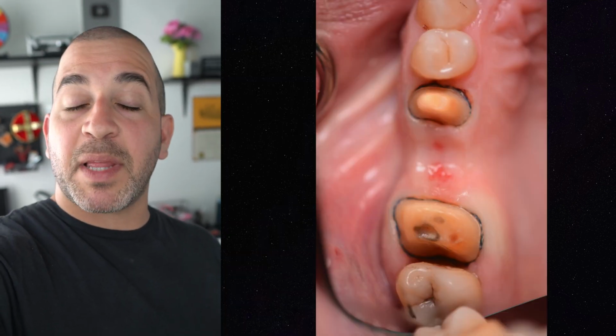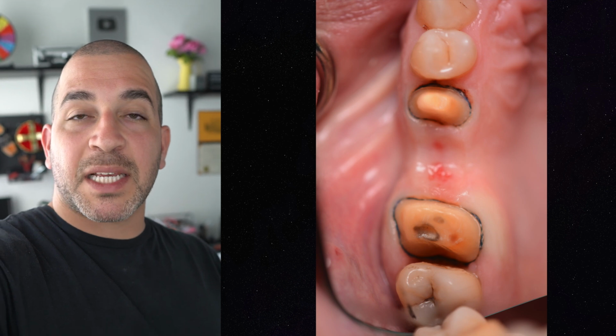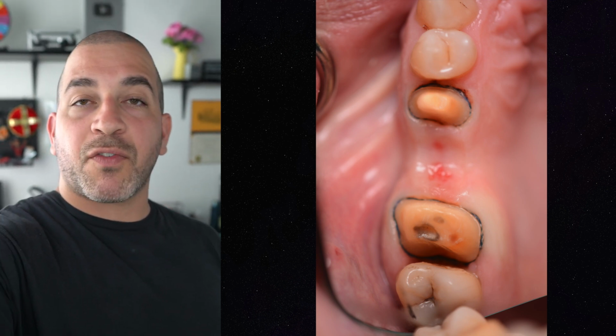When this is done, what I like to do is to scrub the tooth with chlorhexidine, an antibacterial agent that essentially kills any microbes that are sitting on the surface of the tooth. We make sure that our preparation's dry, and we place a cord to essentially move the gums slightly away from the tooth in order for us to take an impression. This impression can either be a digital impression or it can be an analog impression. And with that impression, we're able to send it to a dental laboratory who is able to manufacture a new bridge, and then we cement the bridge in due time.